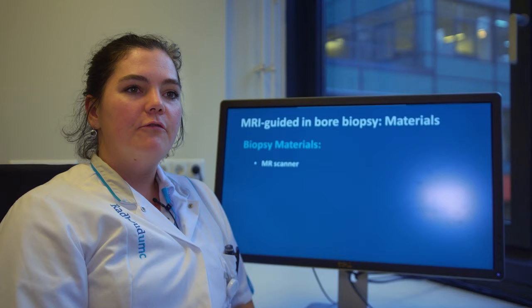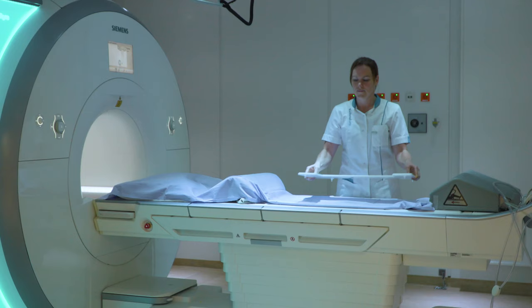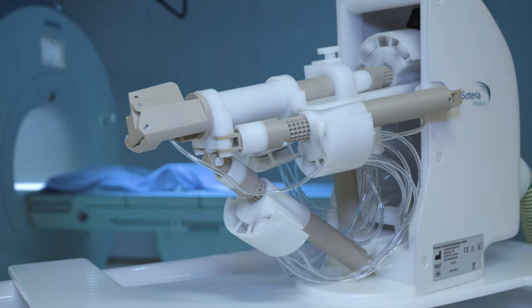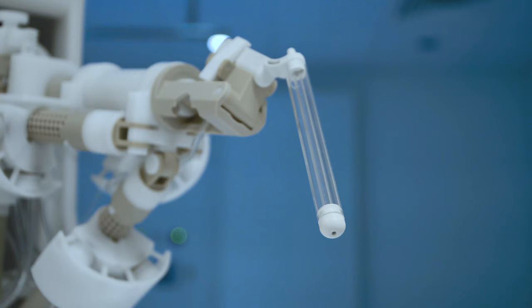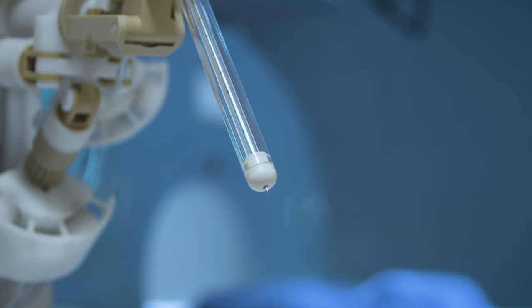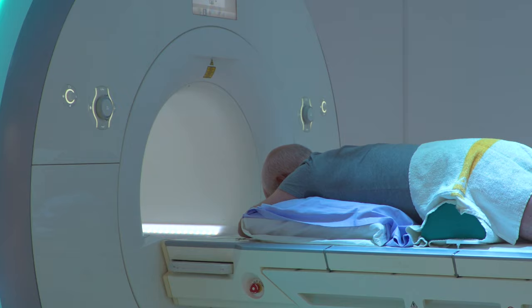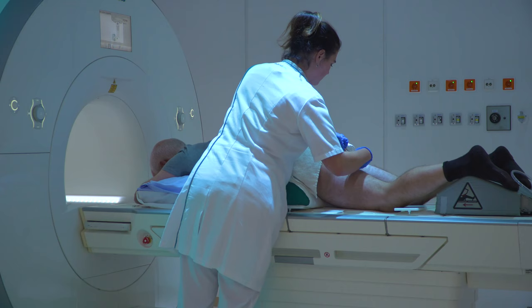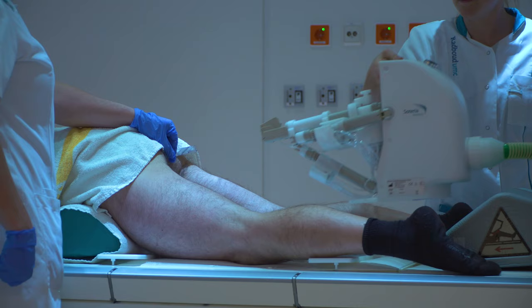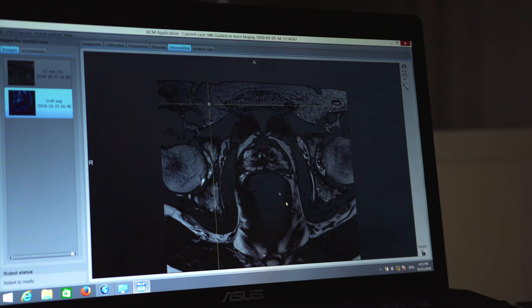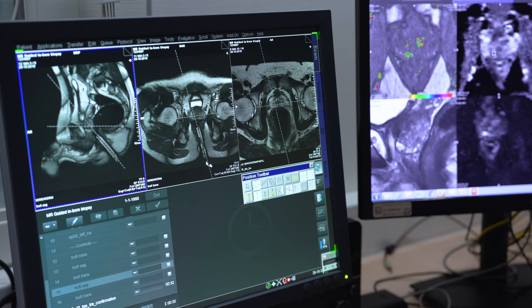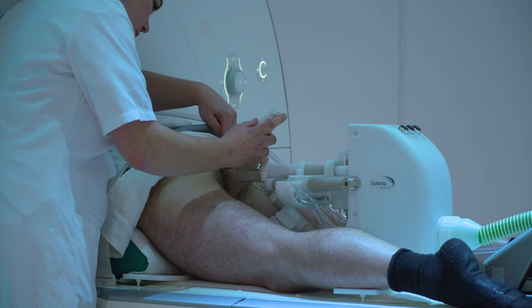For MRI-guided in-bore biopsy, the following materials are needed: an MR scanner, a biopsy robot, a needle guide, and a biopsy needle. First we take care of proper patient positioning — the patient must be as comfortable as possible to avoid movement during the biopsy procedure. Then we insert the needle guide and attach it to the robotic device. We start MR imaging to relocate the cancer suspicious region. When this is done, we perform biopsy planning with the dedicated software and target the needle guide towards the right position. This is checked with a short control image, and then we take the actual biopsy.